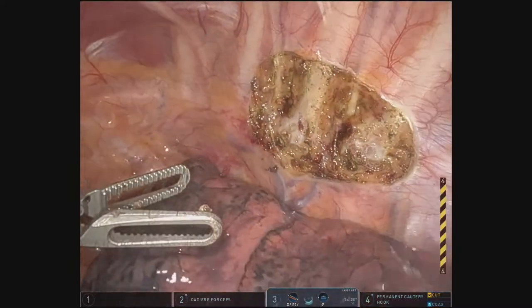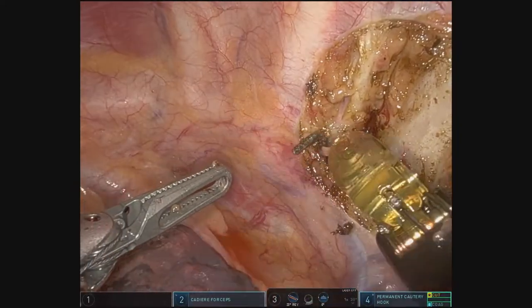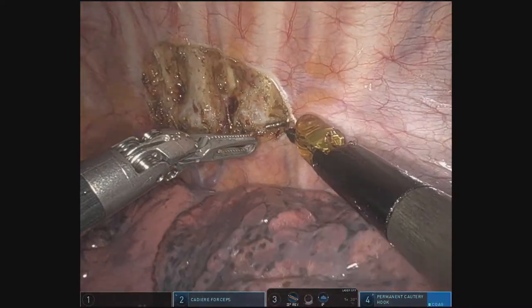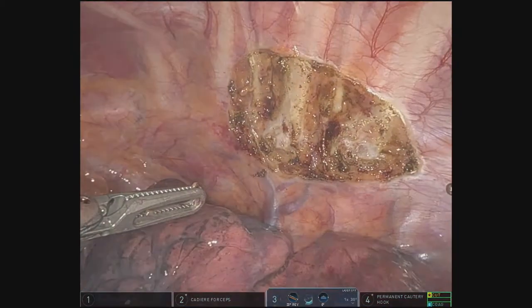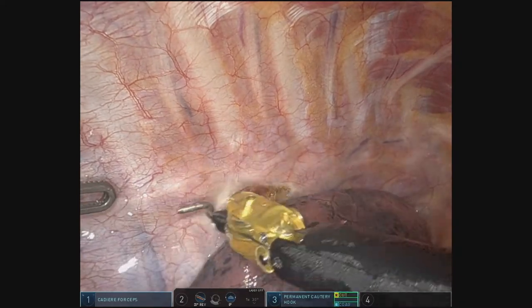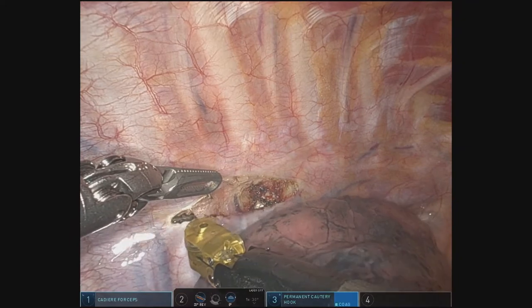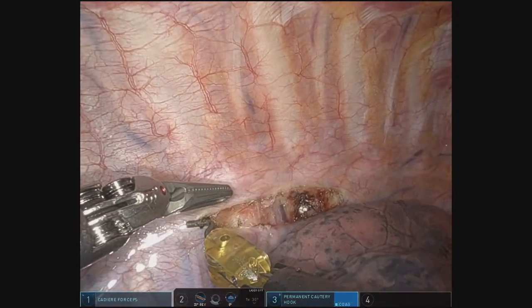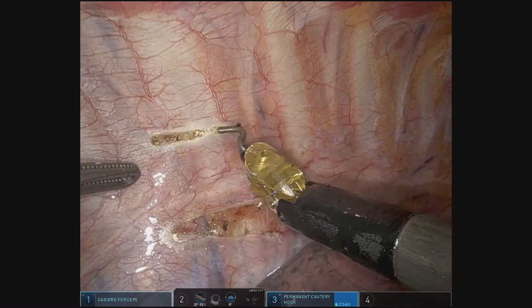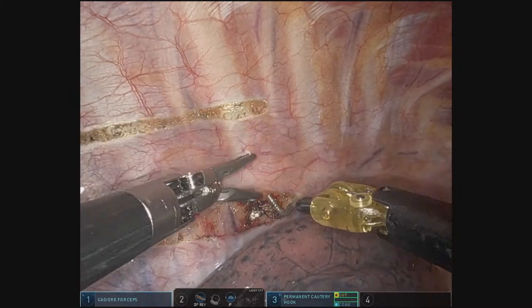Once the left side is done, we make sure there's good hemostasis and then proceed with the operation on the right side. Right there is at level T3, taking down all the way to the level T4. The right sympathectomy is essentially the exact same procedure as done on the left side. The pleura is incised below the sympathetic chain, then incised above the chain, and the sympathetic chain will be ligated with cautery.